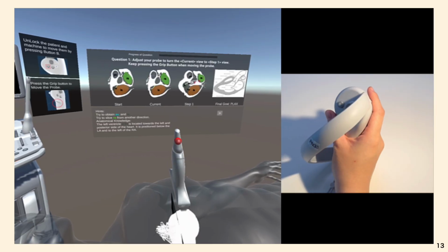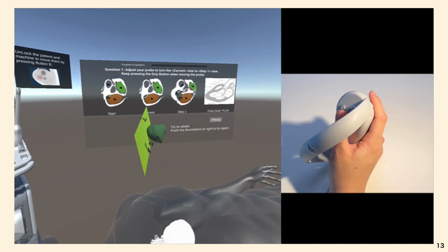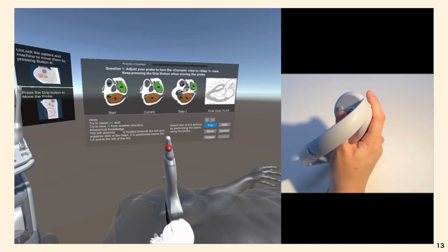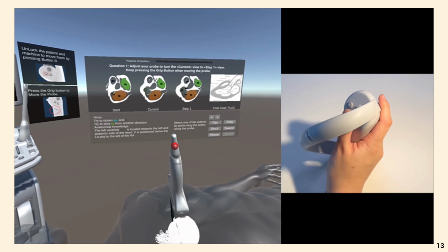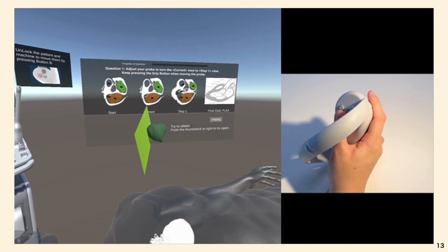Using the sub-goal generation method, we developed Explain MR, an immersive tutoring system designed to simulate various troubleshooting cases with automated explanations. To use it, trainees hold the Pico 4 controller vertically, mimicking a real ultrasound probe.